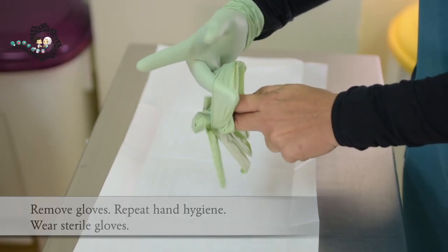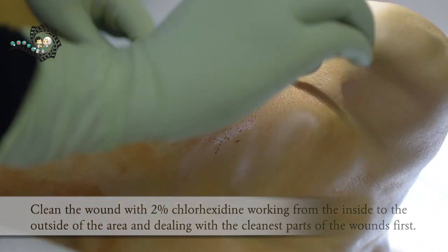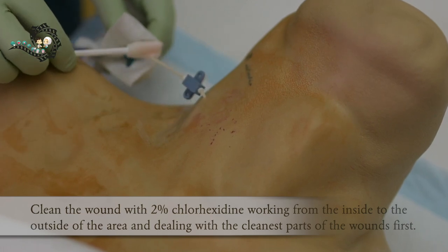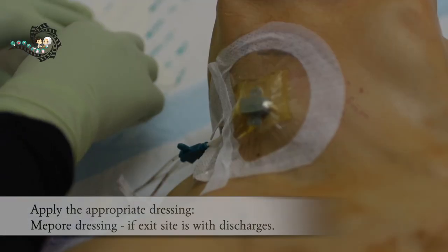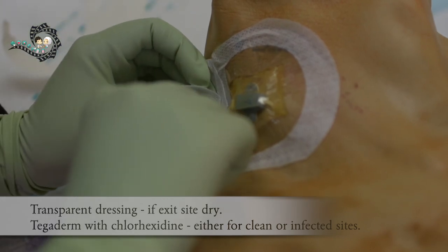Wear sterile gloves. Clean the wound with 2% chlorhexidine, working from the inside to the outside of the area and dealing with the cleanest part of the wound first. Apply the appropriate dressing to prevent infection. Know the suitable type of dressing to be used.